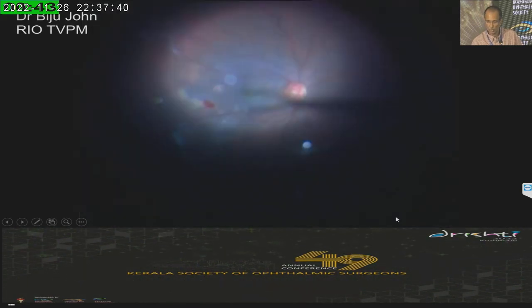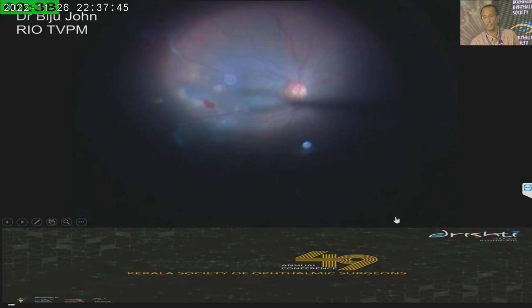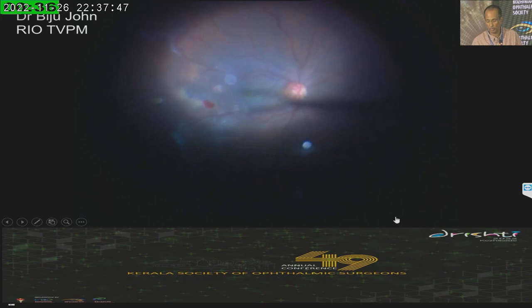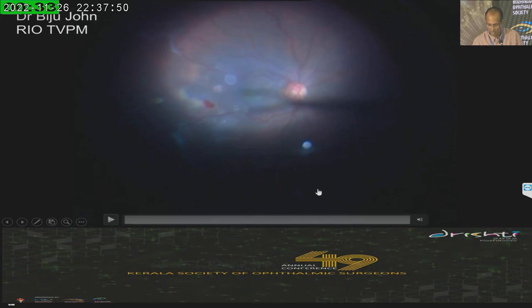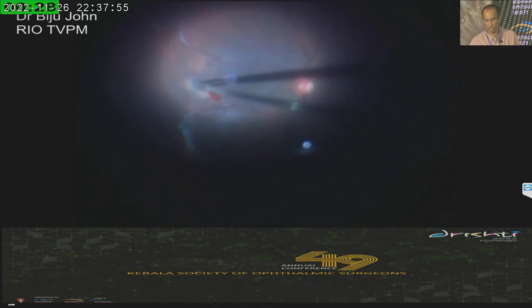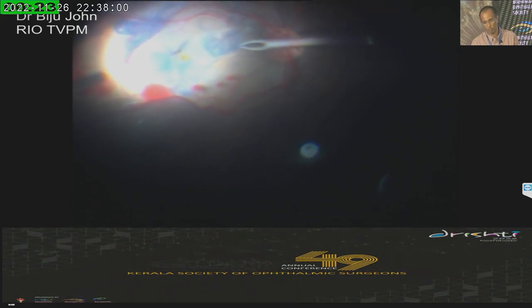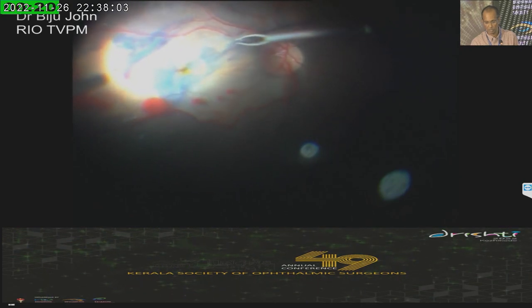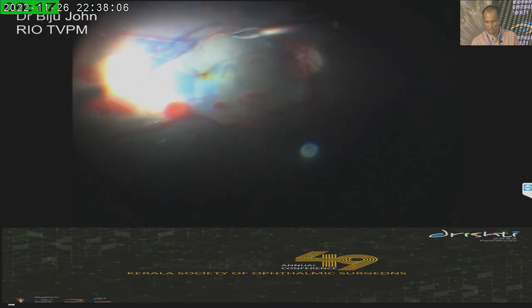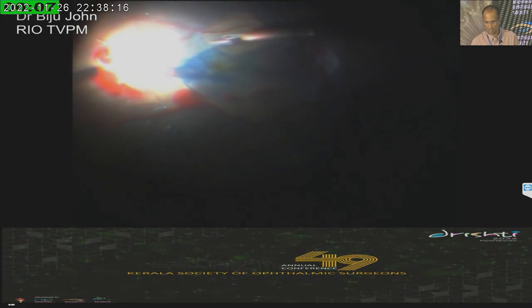In such cases, after removing whatever posterior hyaloid remains, I stain again with brilliant blue-green and start the ILM peeling. I'm grasping with the forceps here — the ILM peeling is being completed. This is mild trauma, which can happen when you are trying to grasp the ILM. So I have to laser that area, even though it was a full-thickness, it may not have been necessary, but it is done.